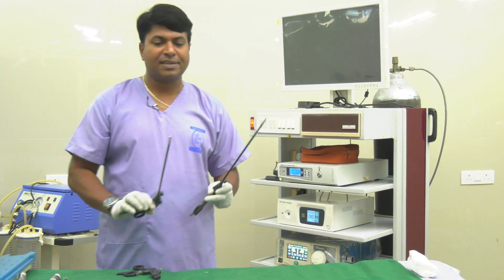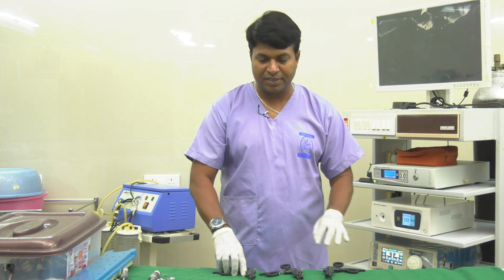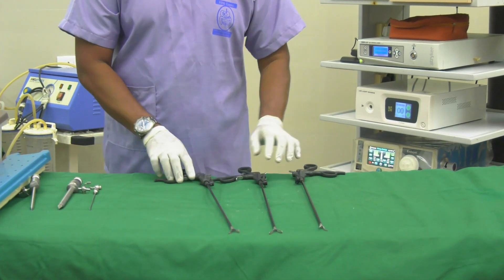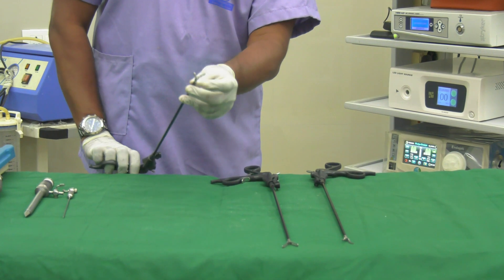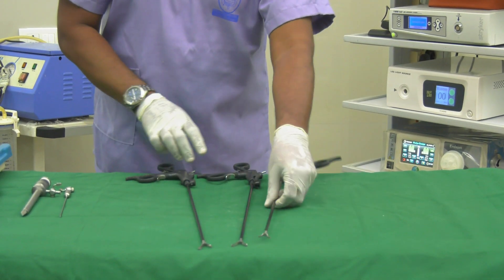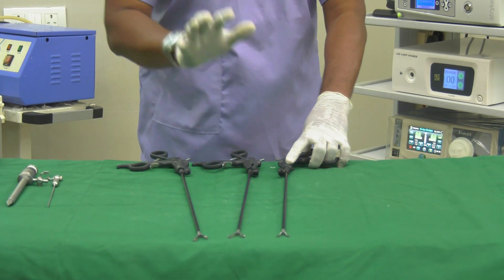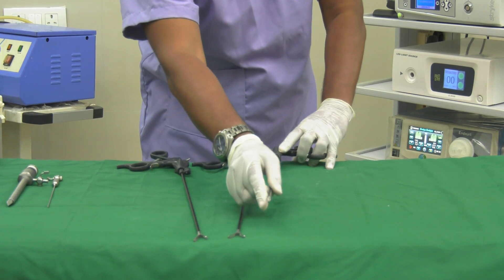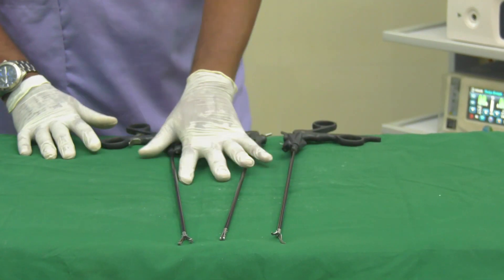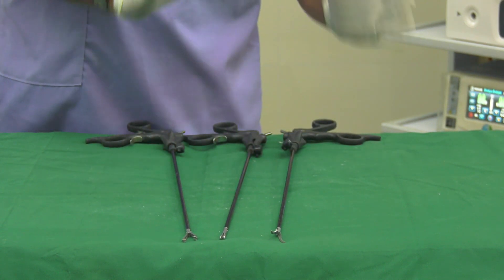Now let's look at the various instruments used in laparoscopy. All instruments are long — unlike open surgery instruments which are short. We have a toothed forceps, a non-toothed forceps, and one that looks like an artery forceps known as the Maryland instrument, used for holding tissues. We also have needle holders, suction devices, and everything else that is available in open surgery.